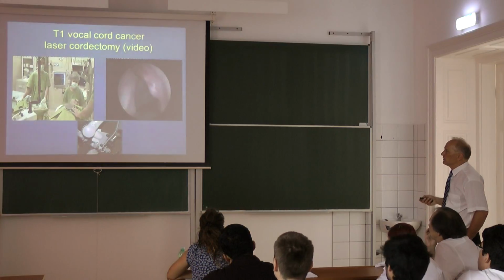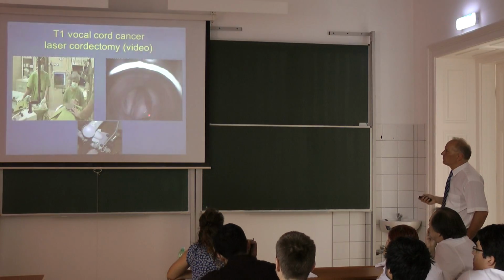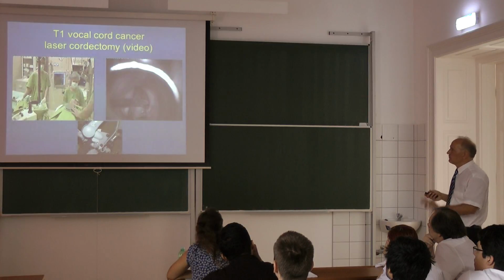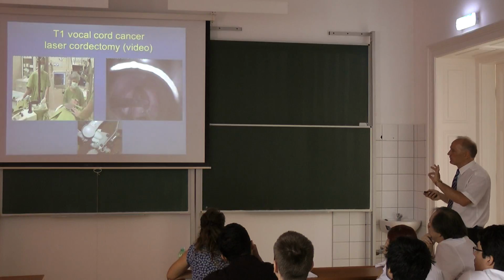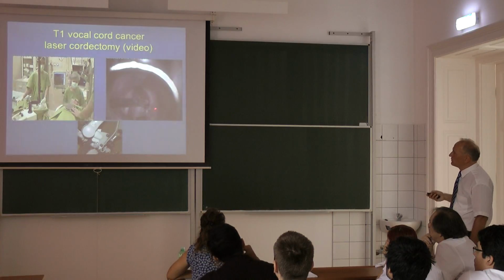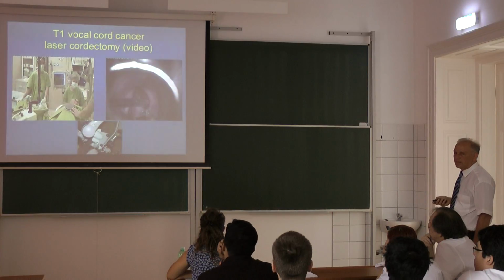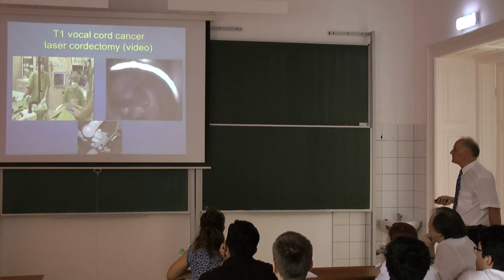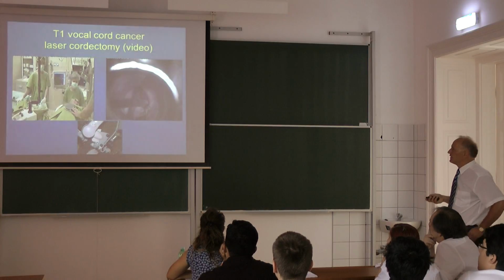set up in the OR for treatment, and you can visualize the larynx and the tumor and explore it, and then you grab the tumor or the healthy margin with a very fine forceps, and try to resect it with the laser easily. But you need some skill for good aspiration and to manipulate the laser easily.